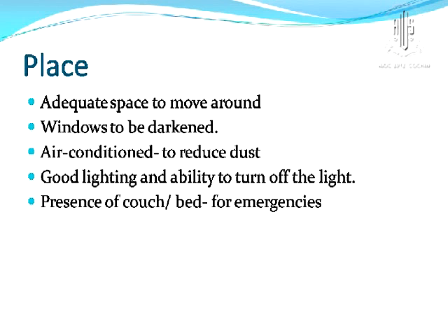The place needs to be adequate. You need to move around the fundus camera, so you need to have a space around it. Windows need to be darkened. You need to be a bit dark adapted to be able to see inside when you're taking the angiography images, because sometimes you keep clicking but then you don't get an image. Air conditioning is generally good because it reduces dust. You need to keep the dust as low as possible because this tends to collect on the lenses and destroy the quality of the image.